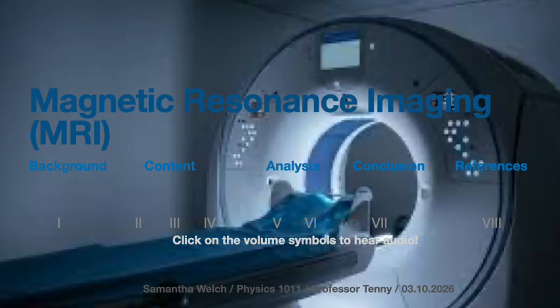When the body is placed inside the strong magnetic field of the MRI scanner, millions of these hydrogen nuclei align with the magnetic field. Because the hydrogen is so abundant throughout the body's tissues, these aligned nuclei create a strong detectable signal.